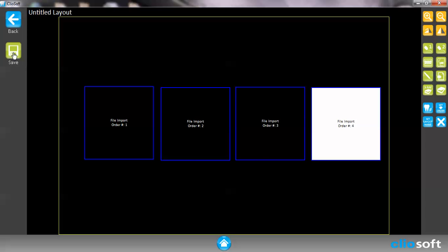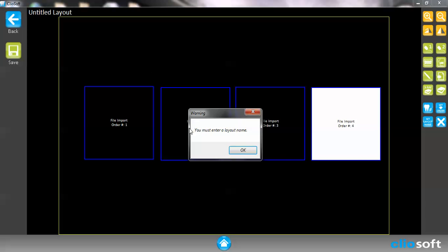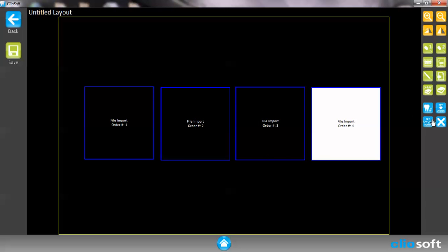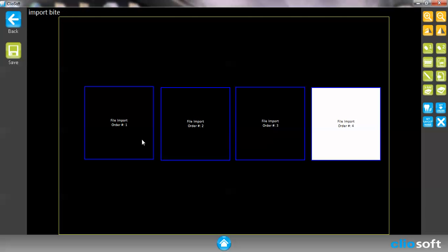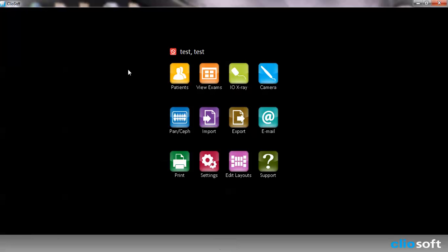If I hit save it's going to ask me to enter a layout name. So I'm going to set a layout name. I'm going to call this my import bite. And you'll notice that it's saved onto the top left hand side. I'm going to go ahead and save that.